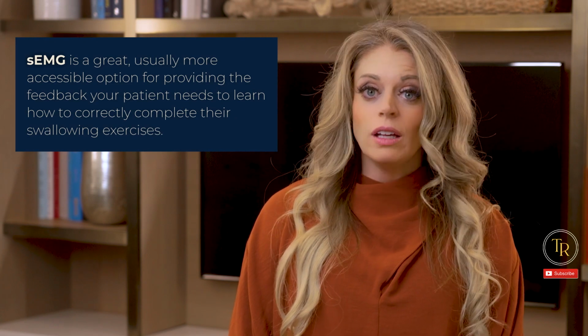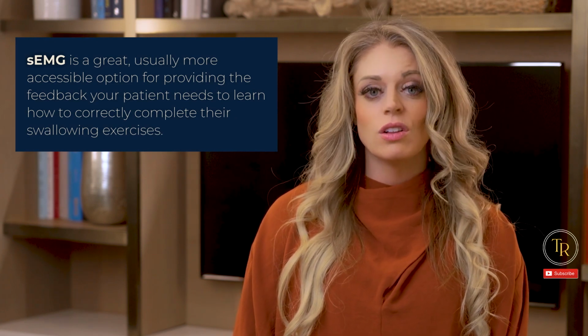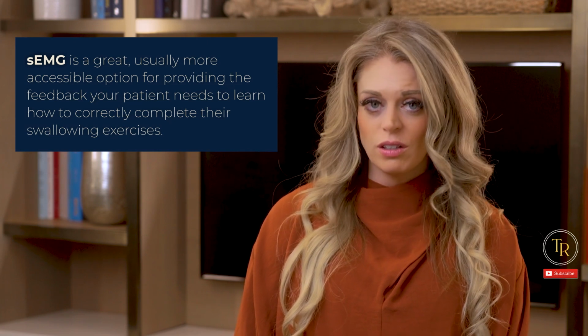I don't know about your radiologist, but the ones I've worked with don't love the idea of any more radiation for the patient than absolutely necessary. And while I would love to see FEES in every facility where SLPs work, I know that's just not the current reality we live in. So all of that to say, sEMG is a great, usually more accessible option for providing the feedback your patient needs to learn how to correctly complete their swallowing exercises.